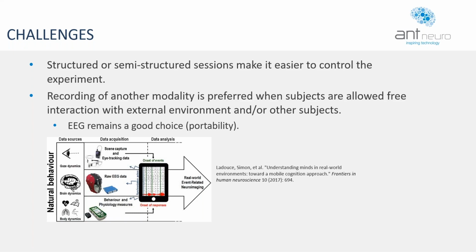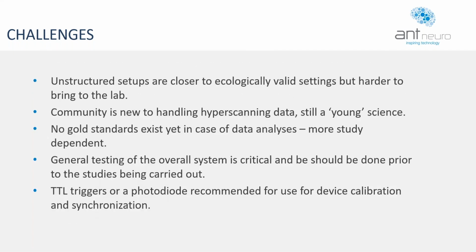So we recommend that another modality is also recorded as a sanity check or a measure. In fact, this is already being done in a lot of studies out there. They have eye tracker information, they have EEG information, or they have motion capture data as an added measure, especially in a mobile context, for example. This brings me to my next slide, which is more on unstructured setups.